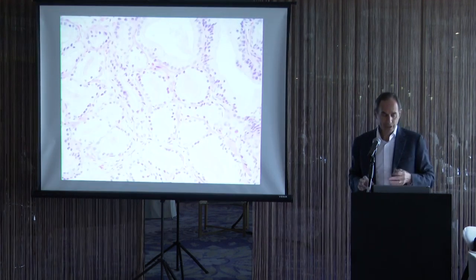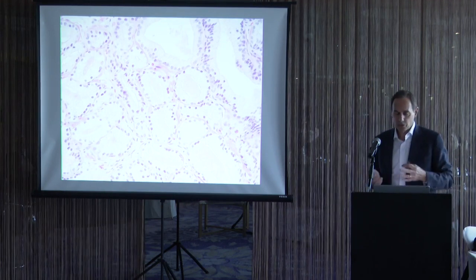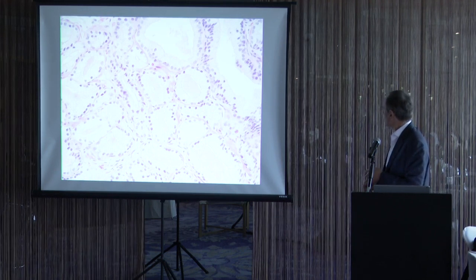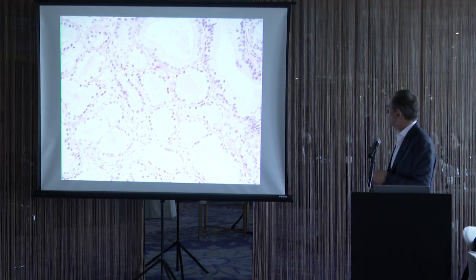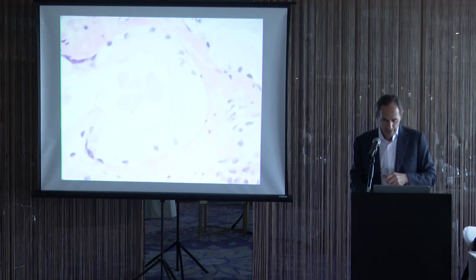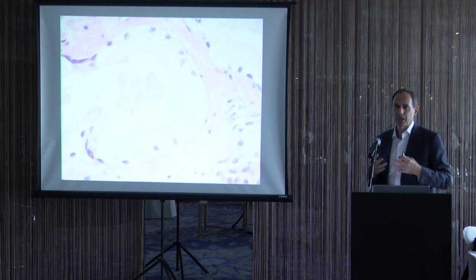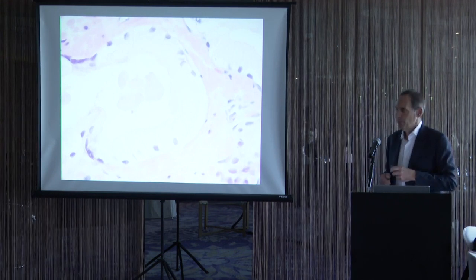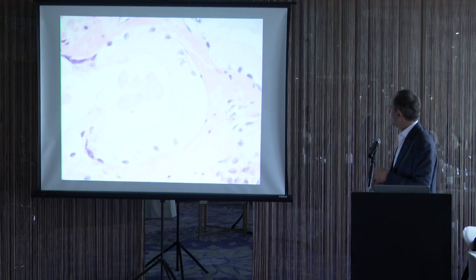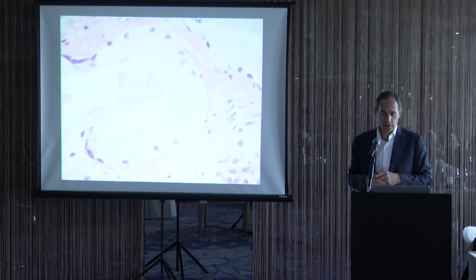So foamy gland prostate cancer will always have crowded glands. So that's your first architectural pattern you think of. Another feature in foamy gland prostate cancer is they often have those dense intraluminal pink secretions. That's a common feature. And then when you go to higher power in foamy gland prostate cancer, that's when you start becoming uncomfortable calling it cancer. And that's because the nuclei just look totally innocuous, totally bland, small, round nuclei with absent prominent nucleoli.